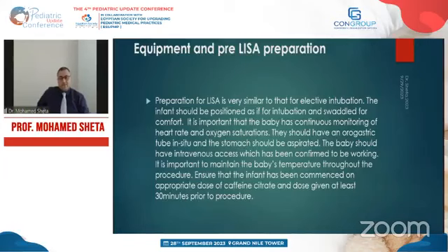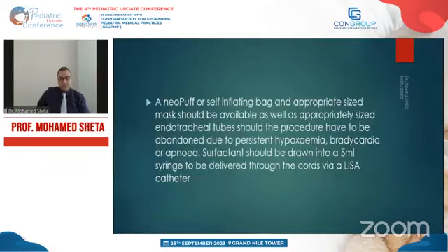Ensure that the infant has been commenced on an appropriate dose of caffeine citrate, given at least 30 minutes prior to the procedure. This will help the baby breathe spontaneously. A neopuff or self-inflating bag with an appropriately sized mask should be available, as well as an appropriately sized endotracheal tube, in case of hypoxia, persistent hypoxia, bradycardia, or apnea during the procedure.